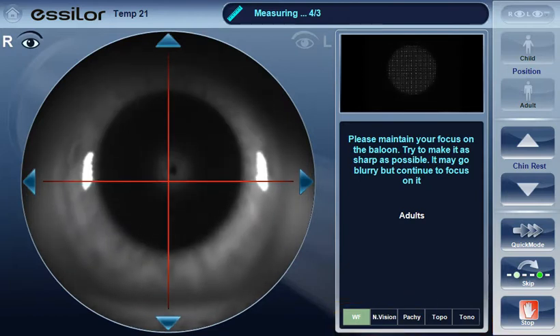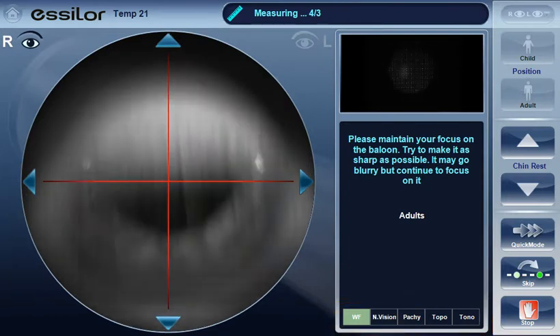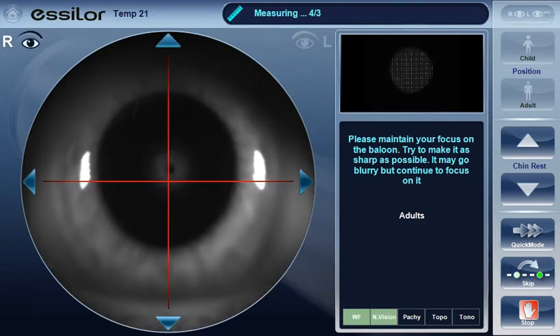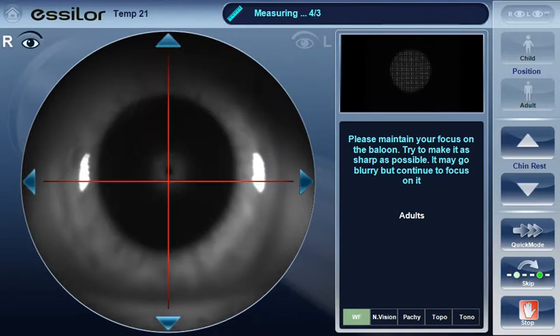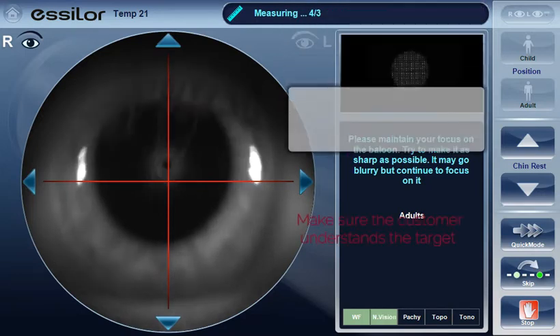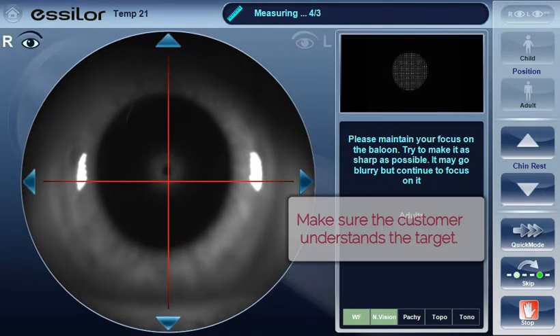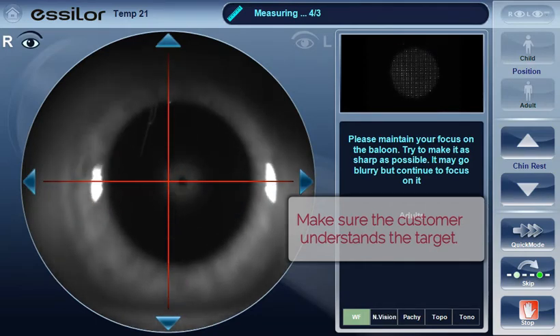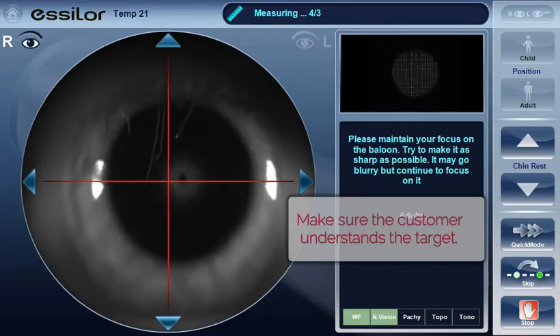The eye strain assessment is subjective — it requires good collaboration from the patient. Please insist on the effort that must be done to keep the target as clear as possible. Please maintain your focus on the balloon and try to make it as sharp as possible. It may go blurry, which is normal, but make the effort to keep it as sharp as possible.